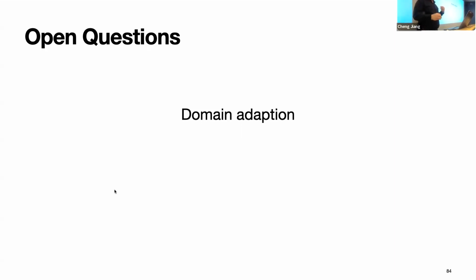But we can actually try to adapt SRH to the conventional H&E histology, and adapting these different methods is a very large scale benchmark that's actually based on the image properties, right, from optical imaging or from staining.